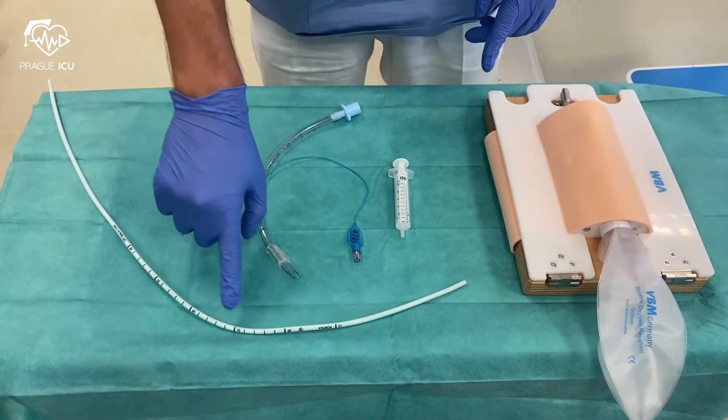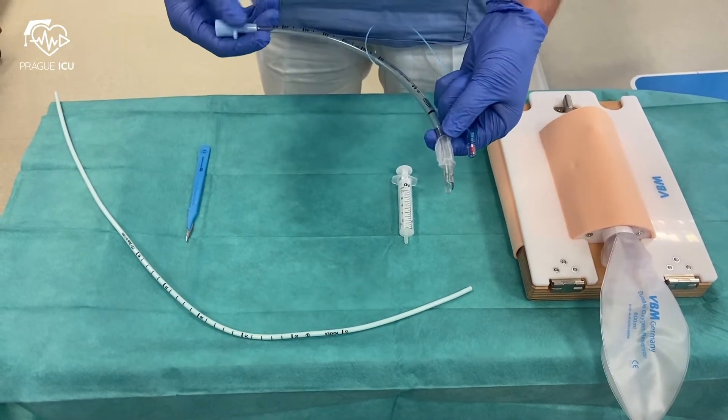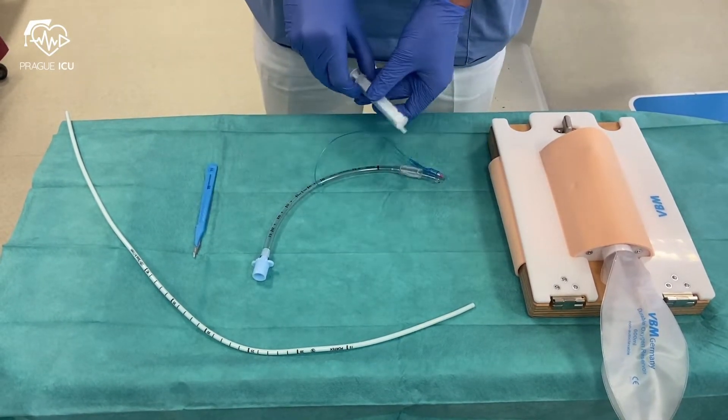Scalpel, bougie, and size 6 endotracheal tube with a 10ml syringe for cuff inflation.